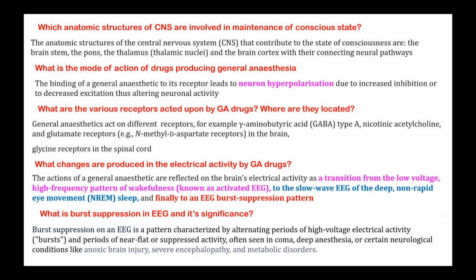See, normally when you are awake, I told you, it is a regular pattern of electrical activity, the low voltage, high frequency pattern that happens in wakefulness. But once you try to make a person unconscious, whether by a pathological condition or on purpose, to tolerate the nociception and surgery, there is naturally a reactive phenomenon in the brain. It doesn't want to become unconscious necessarily.